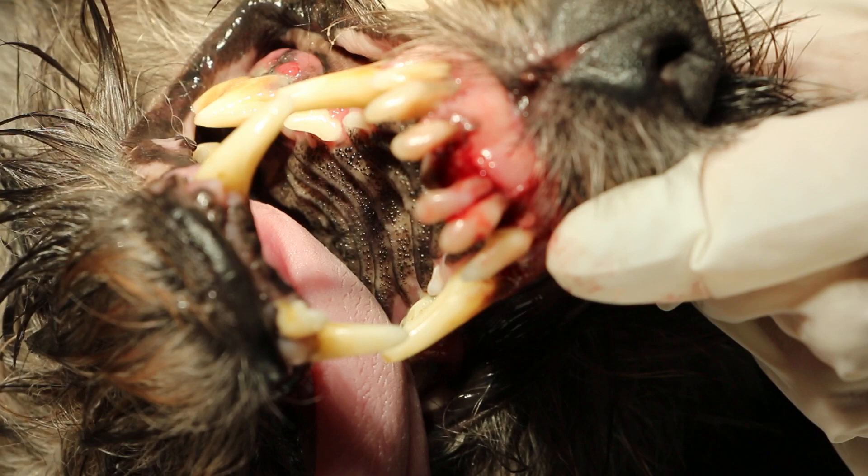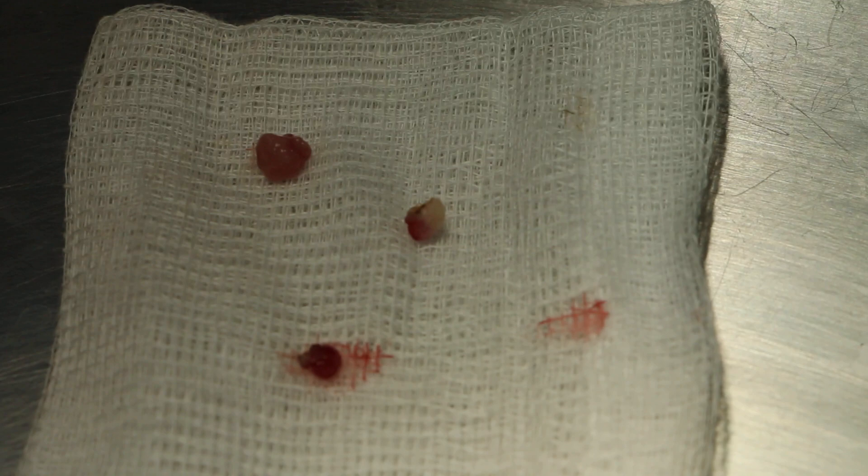This gum tumour in this old dog, nine years old, Cairn Terrier male, neutered, has been removed using electricity.